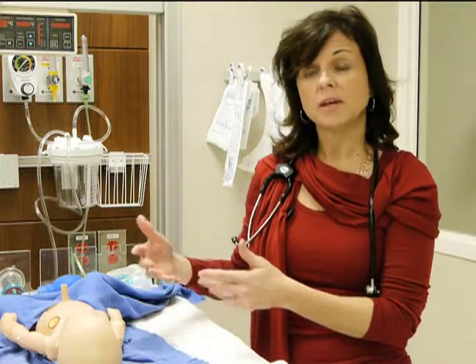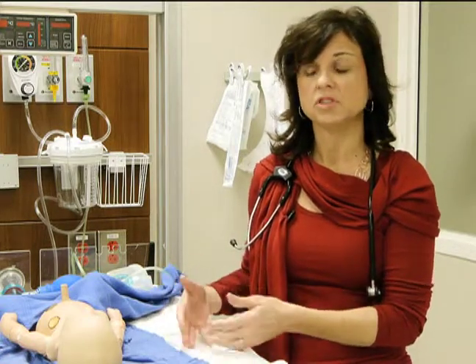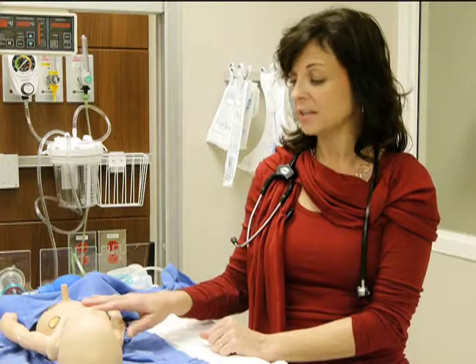We've got virtual reality simulators and haptic simulators. Those are ones that may not look like a patient, but can reenact specific procedures and give the learner a feel of doing a specific surgical procedure. We've got simulators like the one here, which we call human patient simulators, that are a close approximation to an infant or an adult. And these will reenact typical physiology.